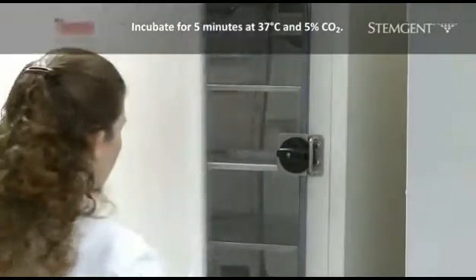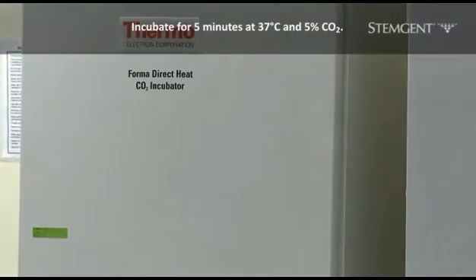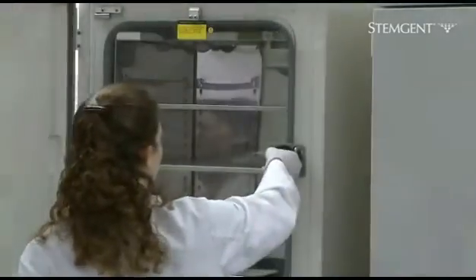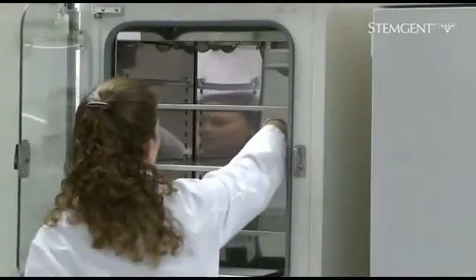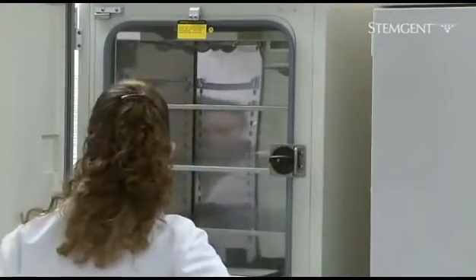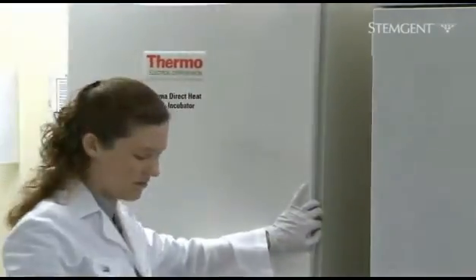Incubation times will vary between cell cultures and colony sizes. Begin checking the culture after 3 minutes. Do not over-incubate the culture, as HES cells are sensitive to enzymatic stress and may lift from the plate during the wash step.